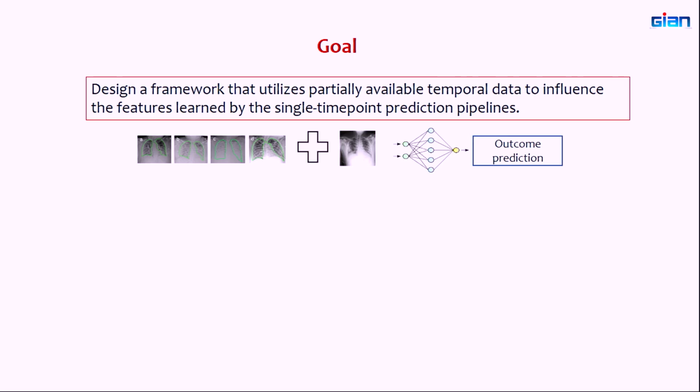Let me go back to the analogy of the radiologist looking at snapshot scans versus temporal scans. I come in today, the radiologist looks at my scan and tries to understand what is going on in that image, but they try to calibrate what they are inferring from this snapshot image with respect to the temporal images that they have seen previously.